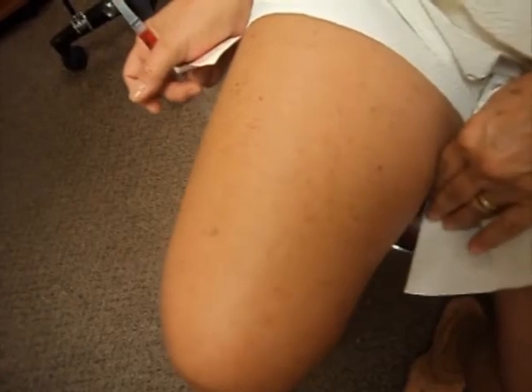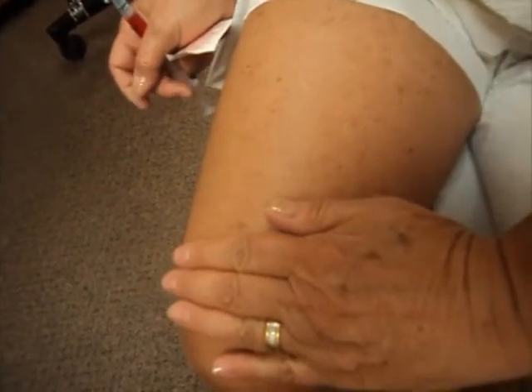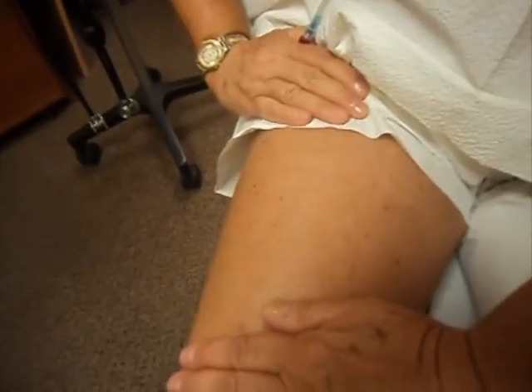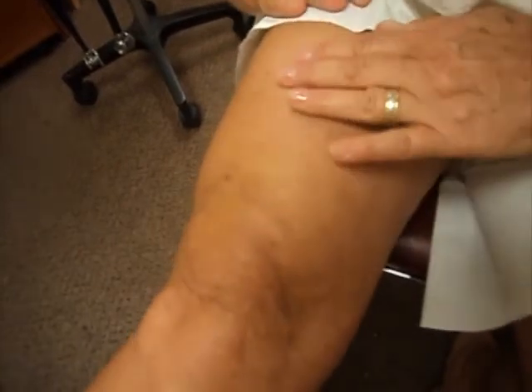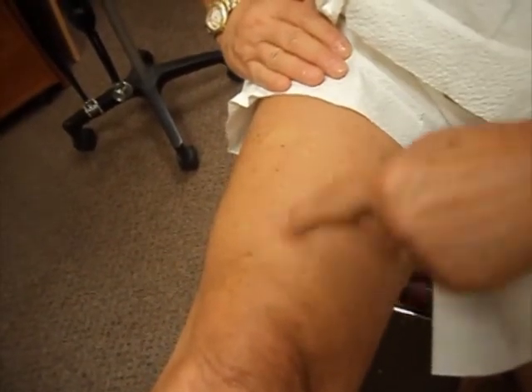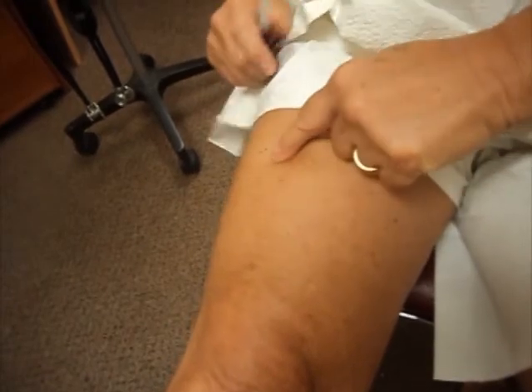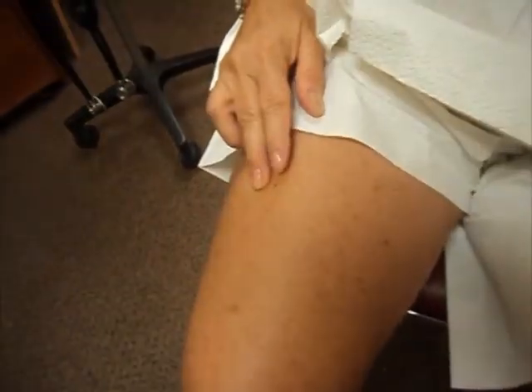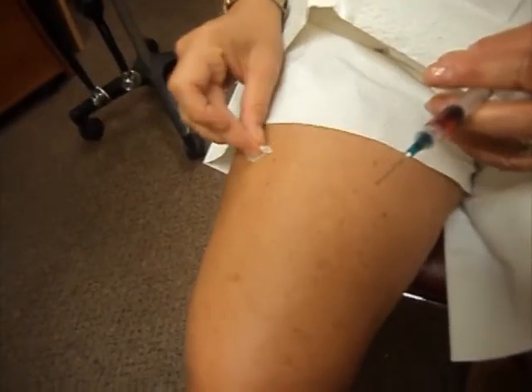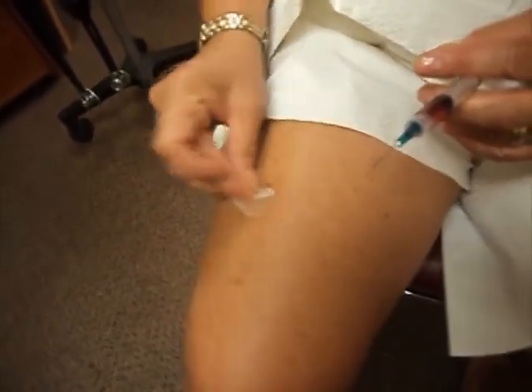We're going to demonstrate the injection technique in one step so you can see how the flow is. Again, a hand by the knee, a hand by the hip, so we have this area. We'll make a muscle, and we can see that this person, we're right over the muscle. We don't want to go midline, we want to go off to the side. The person can relax. Oh, we give it a clean, again, going from the inside out.